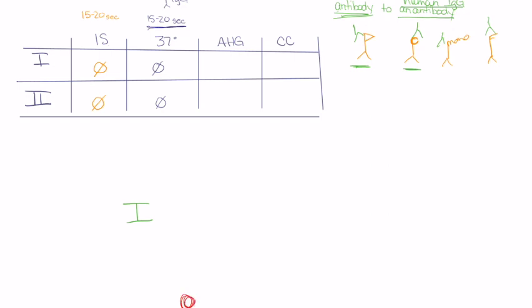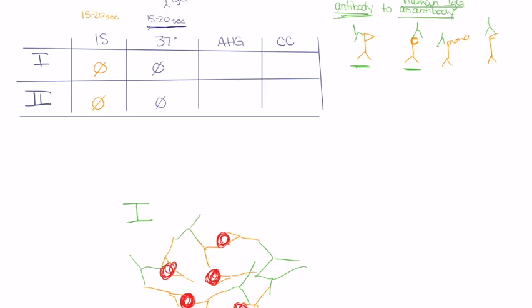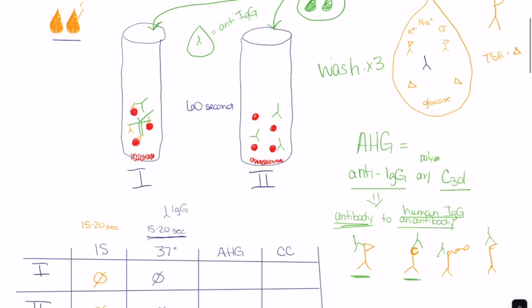we have those multiple red blood cells in there, that had this antibody on it. And it had multiple ones. Okay. It's not specific that only one occurs. There's usually more than one. Then when we add this, because it's an antibody to that, we're now binding all of these guys together, and we are creating much weaker than the IgG, but we are now creating that lattice formation so we can see agglutination.